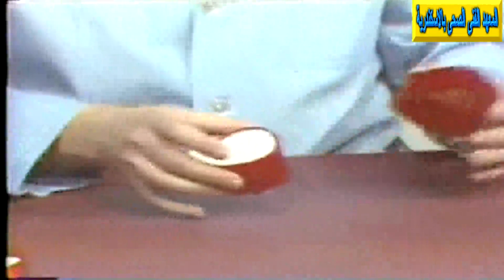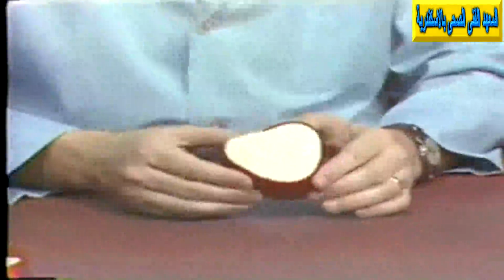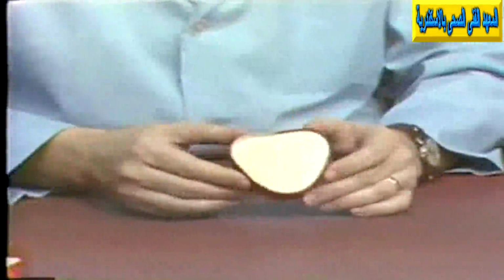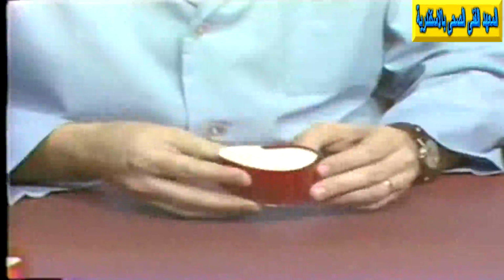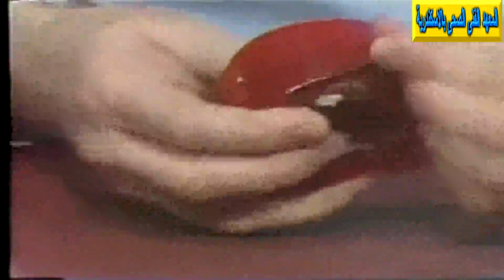At this time, I will demonstrate what the final product looks like. Here's a boxed maxillary impression that has been prepared ahead of time, and it has been poured in the manner we just mentioned. After it is set, and let it set for about a half an hour. Don't take it out too soon. It is simply recovered by removing the wax strips that we added before.